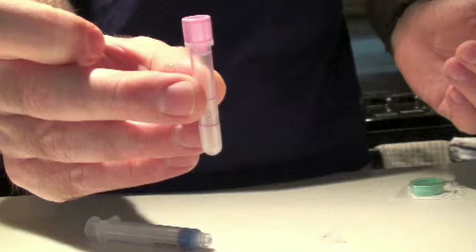These little pediatric blood bullets have caused us all a lot of misery, along with our patients and their parents, because they clot over and over again and we have to keep going back and sticking the patient.